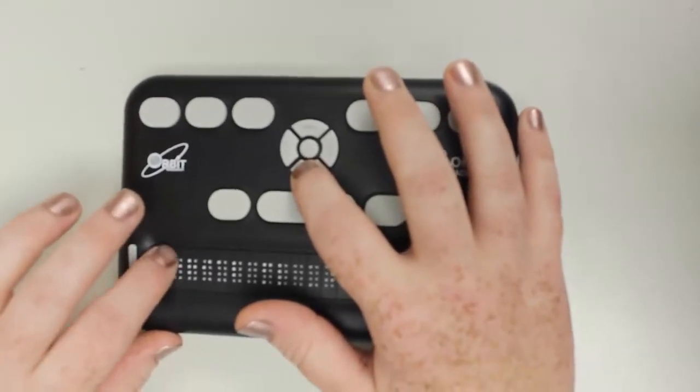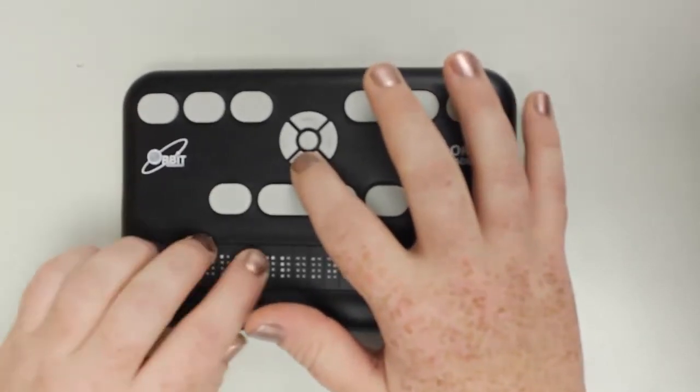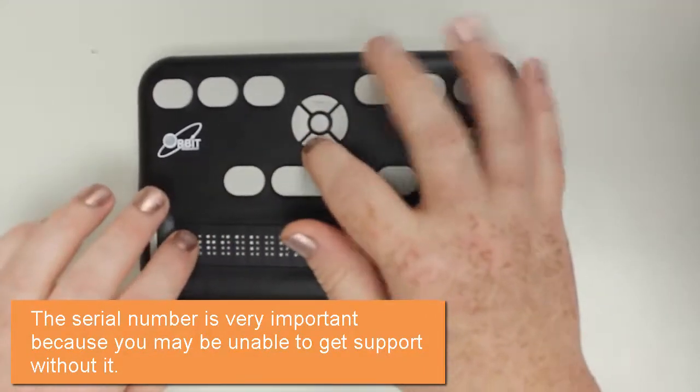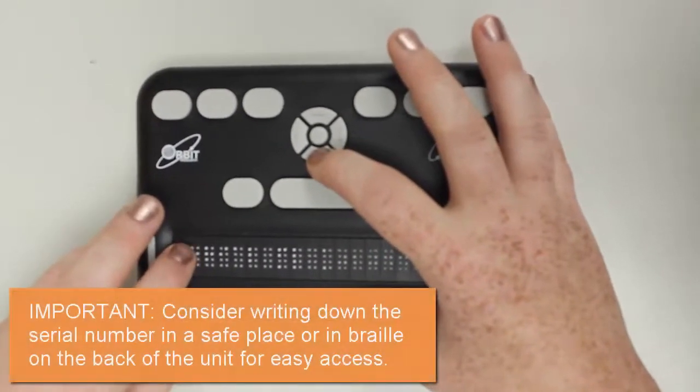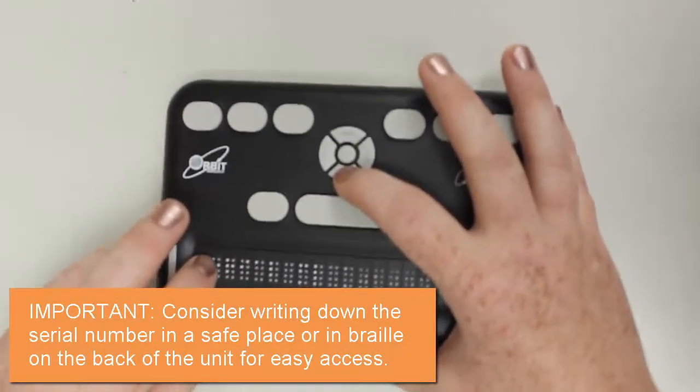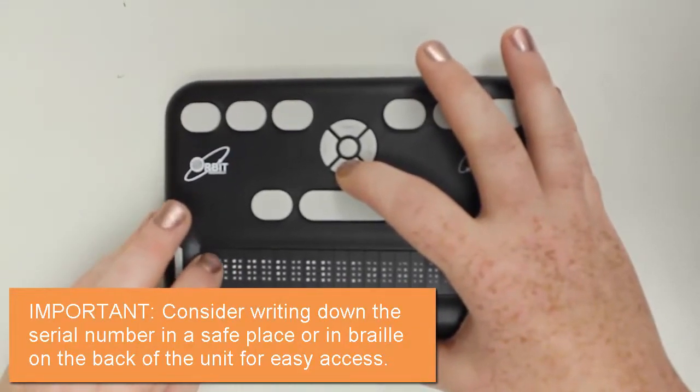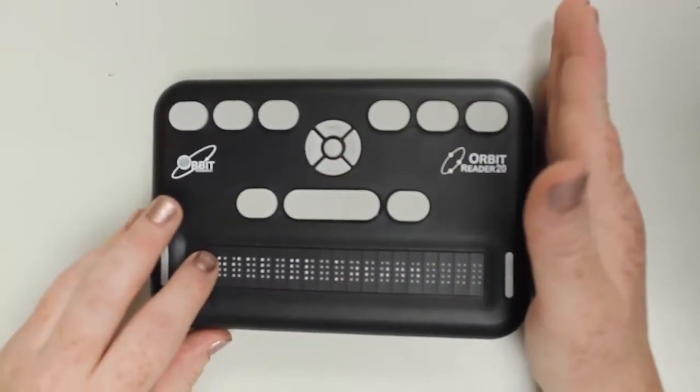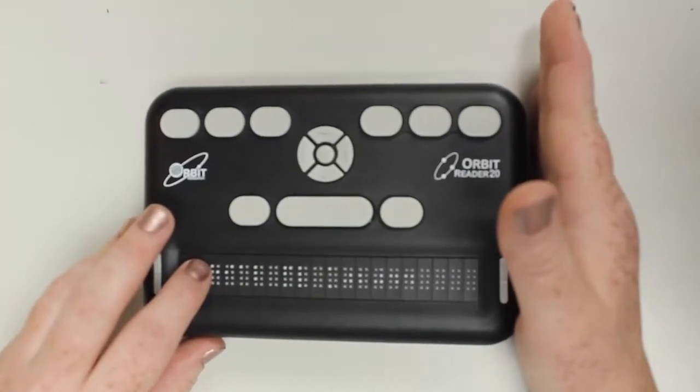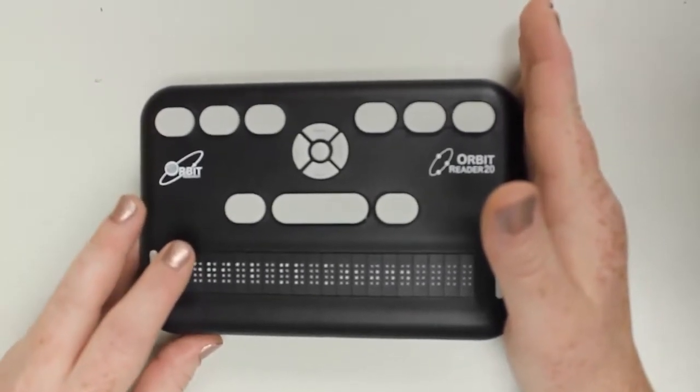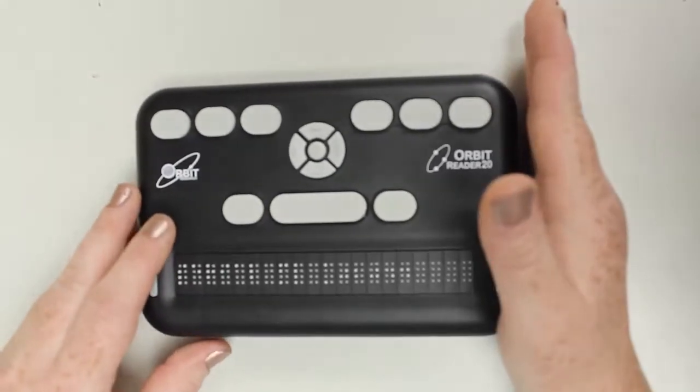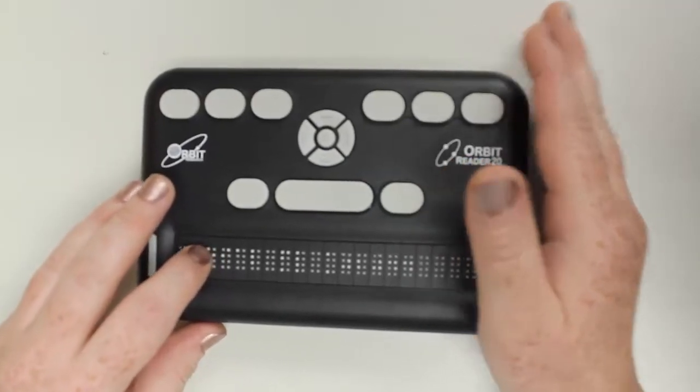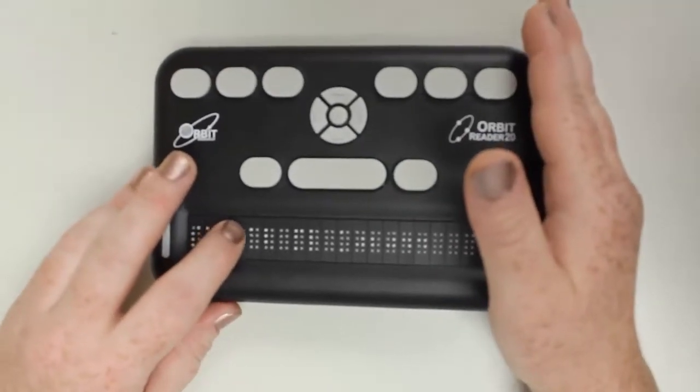The next thing that they may ask you for is a serial number, and that is here. So that is the next choice in the menu. I would advise you to write down the serial number either in Braille or in a file somewhere that you can access that is not on this device. If the unit isn't working and you need the serial number, there's no way you can get to it. It's kind of like this vicious circle. You need the serial number to get it fixed, but you can't get it fixed to get the serial number off of it.